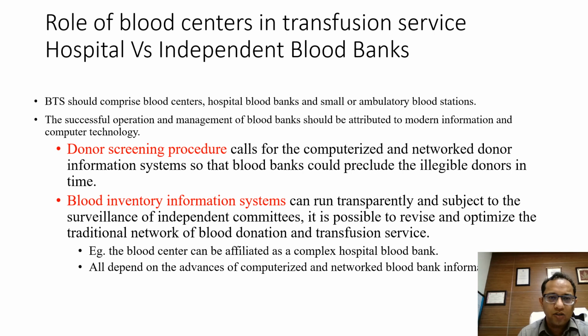Any BTS should comprise a blood center, hospital blood bank, small or ambulatory blood station, and the successful operation and management of blood banks should be attributed to modern information and computer technology. So you have two very important aspects in this. These are the donor screening procedure, which needs to be computerized, and a network donation information system should be there. And the blood inventory information system should run transparently and be subject to surveillance of an independent committee.